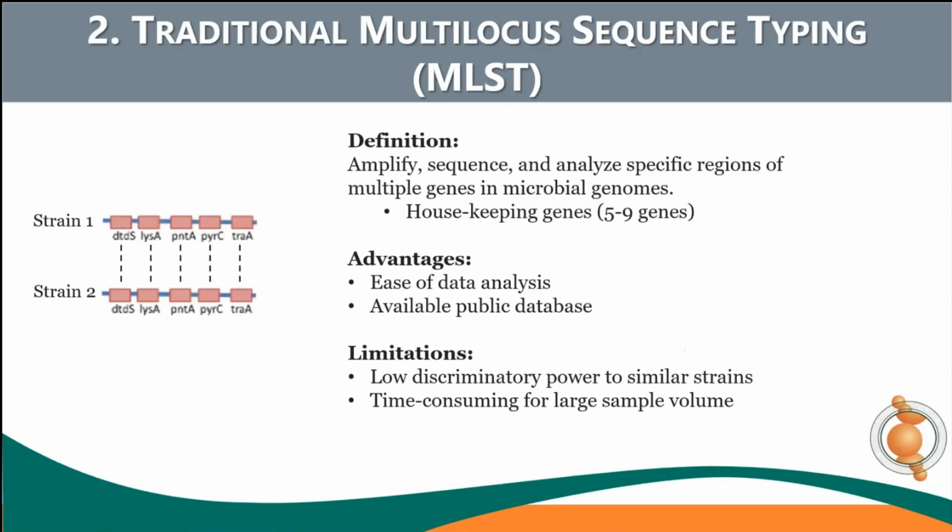Housekeeping genes here are the genes that are consistently expressed and conserved across all the species. So the sequences of the housekeeping genes should be similar between related strains, but different if the tested strains come from different sources.